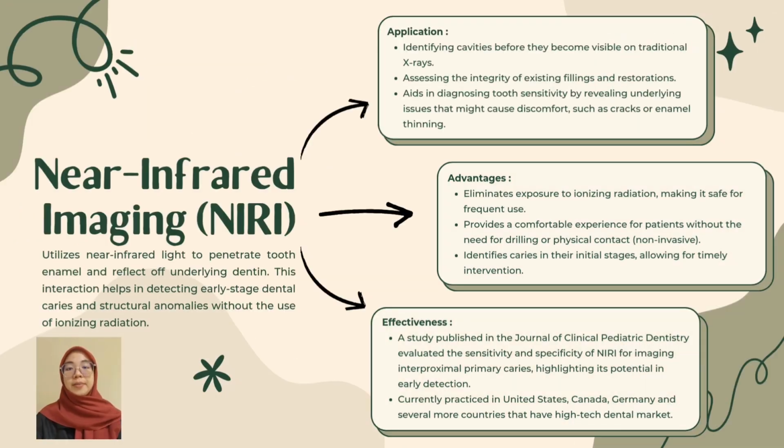Next is near-infrared imaging. NIRI offers a non-invasive, radiation-free approach to dental diagnostics. This technology uses near-infrared light to penetrate the enamel and reveal the structural details within the dentin, enabling the early detection of decay, cracks, and also enamel thinning. Unlike traditional methods, NIRI provides a comfortable and safe imaging alternative, which is suitable for frequent monitoring and also real-time diagnostics. It has gained widespread adoption in advanced dental markets like Canada and also Germany for its ability to identify dental issues at their earliest stages.